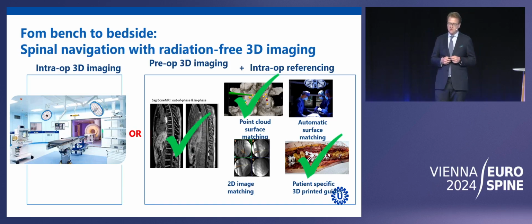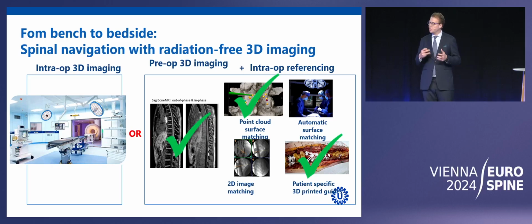You can use the point cloud surface matching. We still have to see whether it also works with other techniques of referencing, but I think these options are now available.